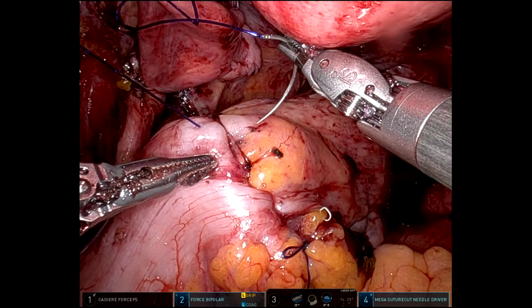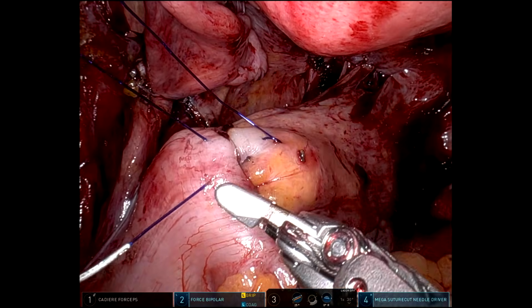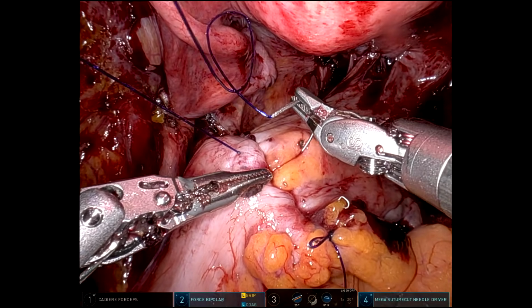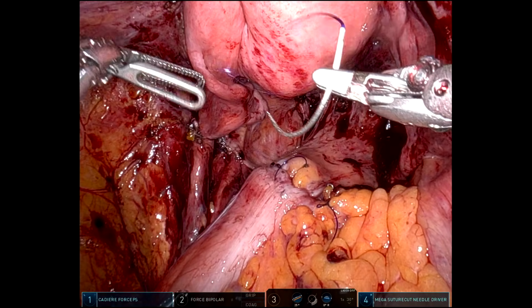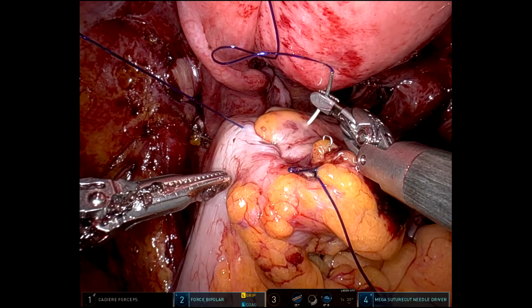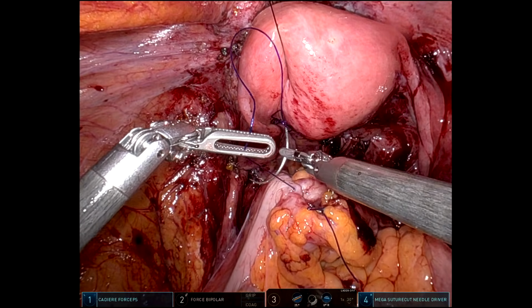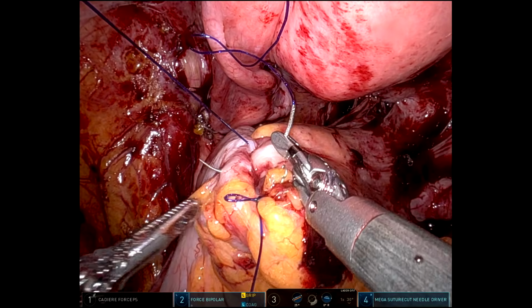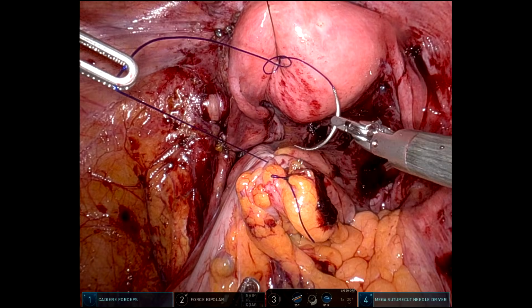So I did do a hand-sewn anastomosis. It's the same one you've always seen me do. I'm just setting things up really clearly for our fellows so that she can learn the ergonomics of things. Working with all hands, trying to be efficient, showing her that you can go through in one without having to transition the needle. Like that. And by working with arm 1 and 2, keeping impeccable exposure for these bites with stability and good vision, and we'll go ahead and tie to this post.